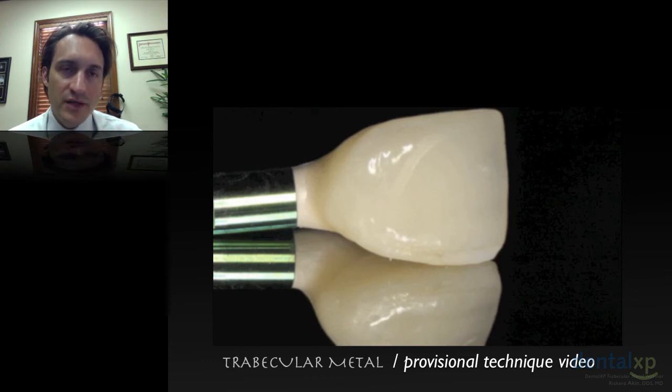I may pause the video because I want to talk to you about a few of the nuances of the drilling sequence and how the implant feels different when it goes in. Like any new implants and new surfaces and new patterns of implant surfaces, there are nuances, and there is somewhat of a learning curve here. So let's get started on this case. And here's the immediate provisional, like I had said, of number 8.